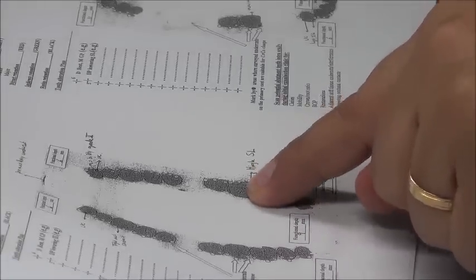That means the denture will go into this undercut, where I have this high survey lines. When the denture wants to go with sticky food upwards in the displacement way, it can't because it's engaging in this undercut. With this, I could eliminate the reciprocal arm and the retentive arm by utilizing teeth undercuts and tilting my path of insertion into these undercuts.